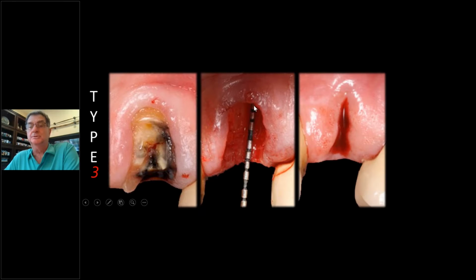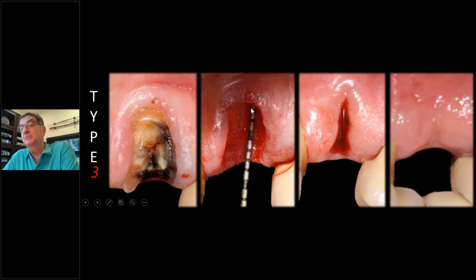Watch it. Here it is at 2 weeks. And here it is at 10 weeks. Now you have just a normal healed ridge with plenty of tissue. Now you still have to graft. There's still going to be a buccal defect there. But now look at all that beautiful, colored, nice, keratinized tissue. So let nature help you with it. Don't be in such a rush all the time.